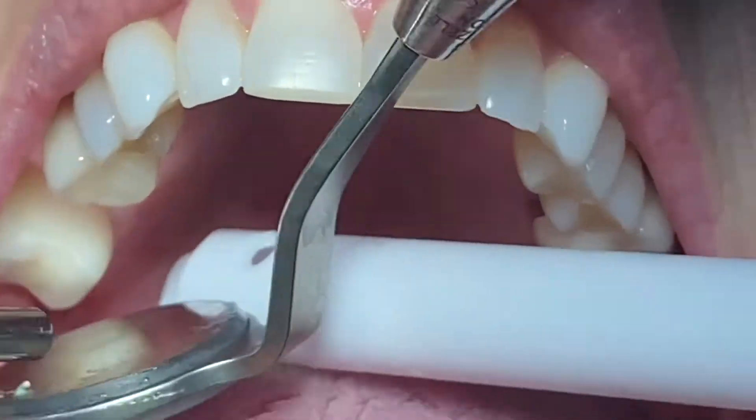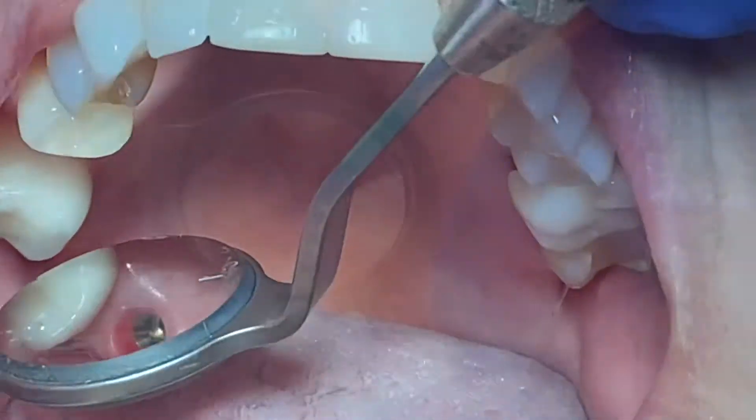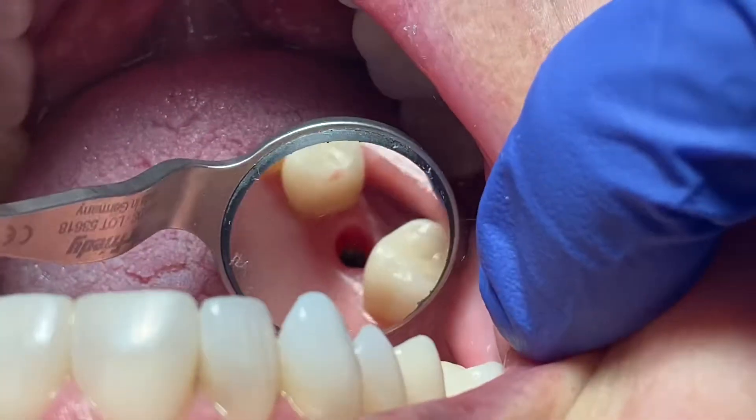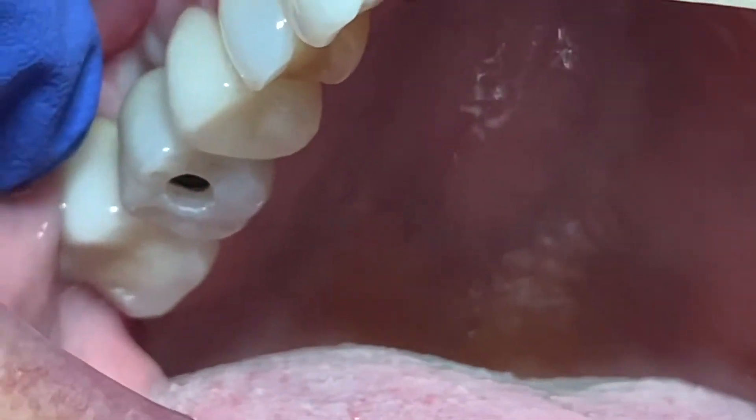After that, I have an opportunity to evaluate how well the healing of the implant site has occurred. Take a look at the healing — that's what you want to see. There should be no bleeding; it should be nice and dry.